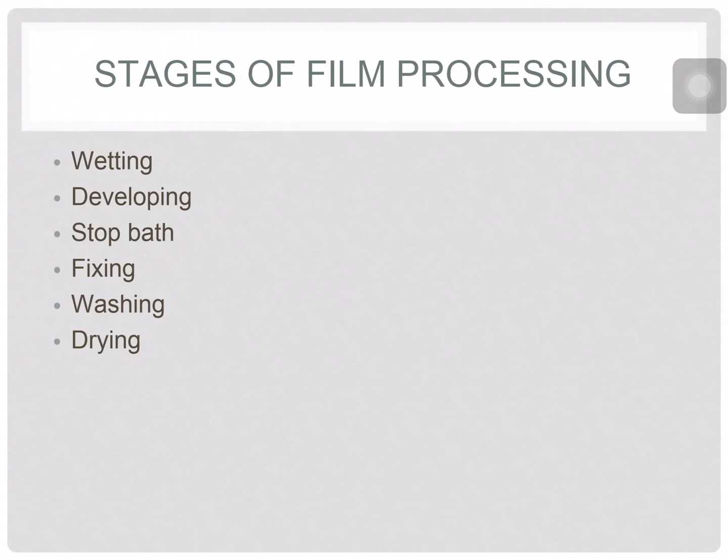Next to the wetting stage is the developing. So, dito kay developing, ito na yung pag-convert ng ating latent image towards to a manifest image. Siya na yung bahalang mag-convert ng latent image para maging visible na yung image. Maging visible na yung nasa radiograph natin.